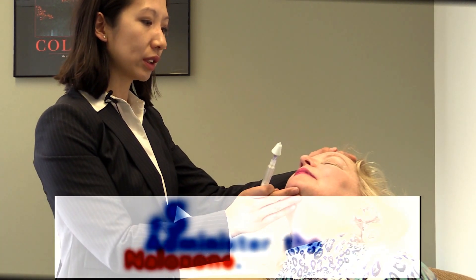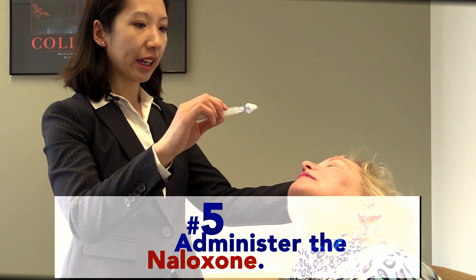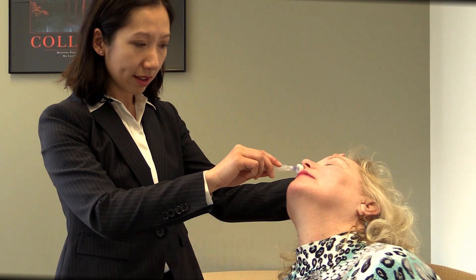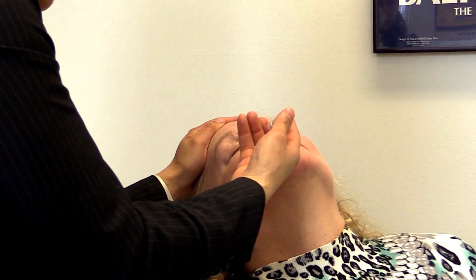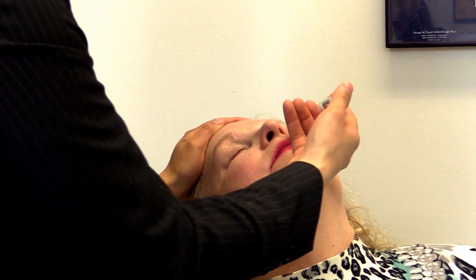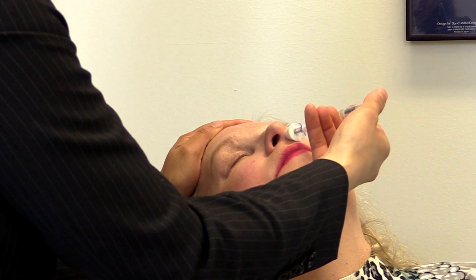Only one more step remains, and this is to give the medication. What you do is hold the individual's head backwards like this, and put the end of this into the individual's nose, and squeeze — and that is all. Half the medication into one nostril, and half of the medication into the other nostril.